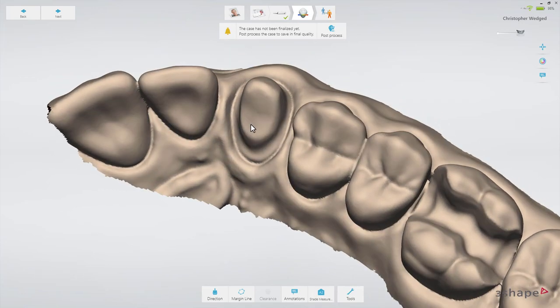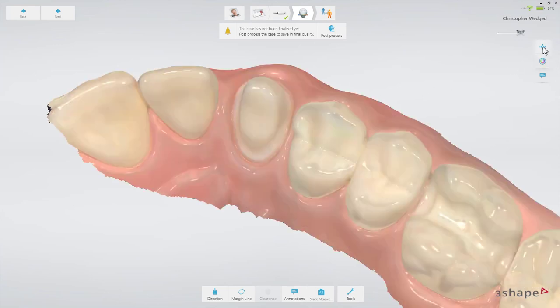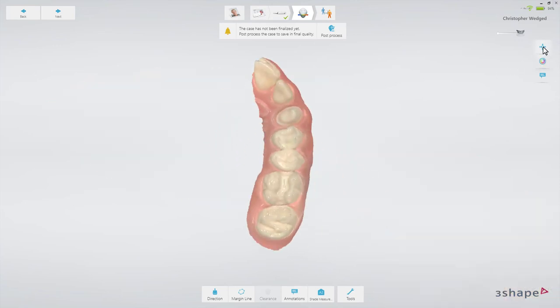In general, 3Shape recommends to post-process before setting the margin line, as the margin will stand out more clearly and consequently will be easier to set. Let's illustrate what to do and the difference it makes.